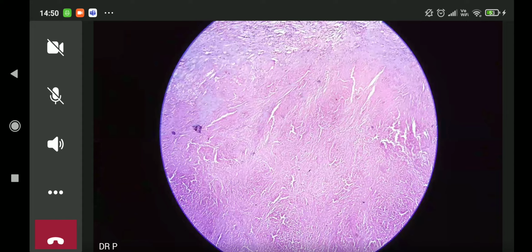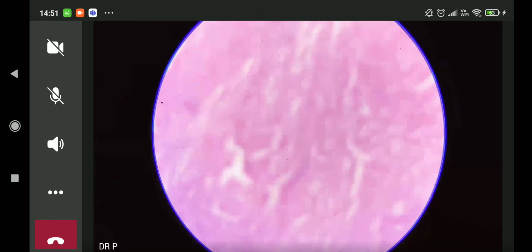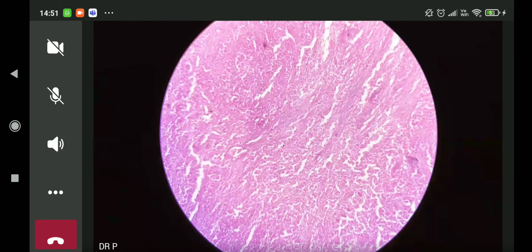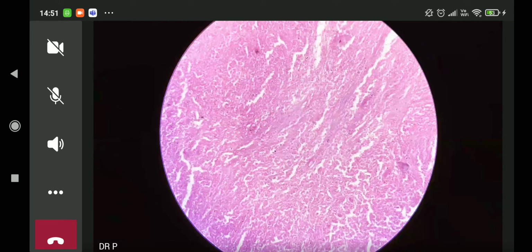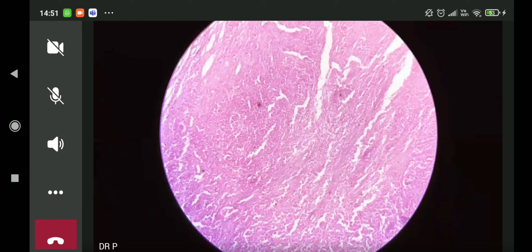the microscopy. Over here, all you can see is an amorphous, granular, inhomogeneous substance with scattered nuclear debris. If you look carefully, it has a very uneven texture, it's not homogeneous. It's just so irregular, and you have these dots that are scattered around, which are like pinpoints. So this is characteristic of caseous necrosis, which is seen in tuberculosis.